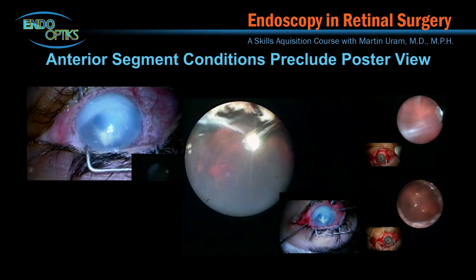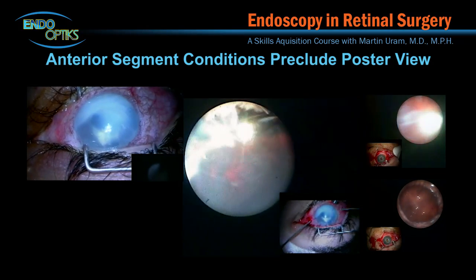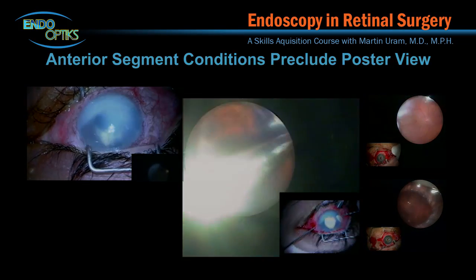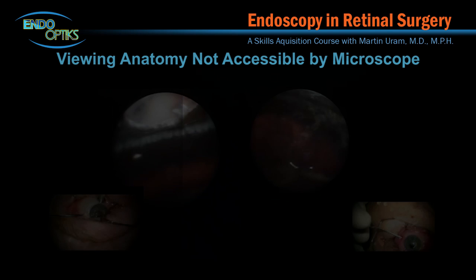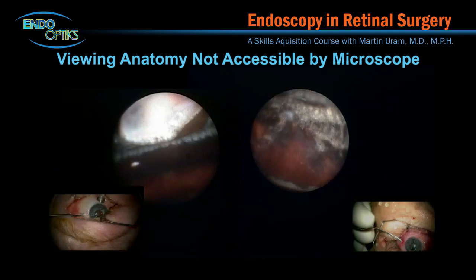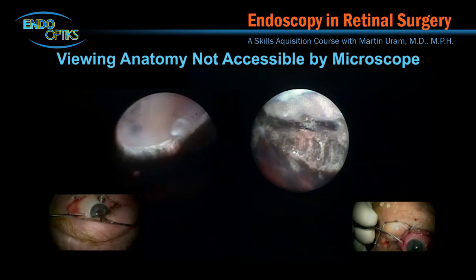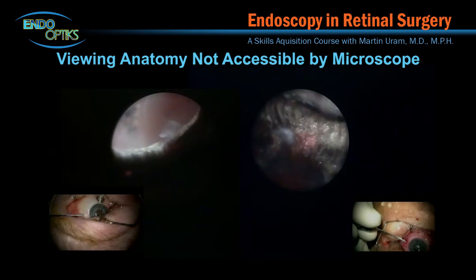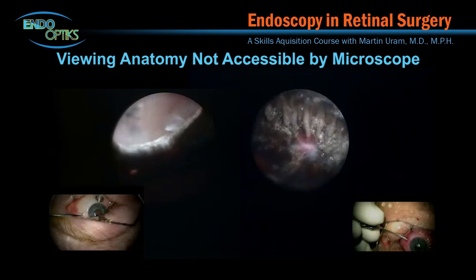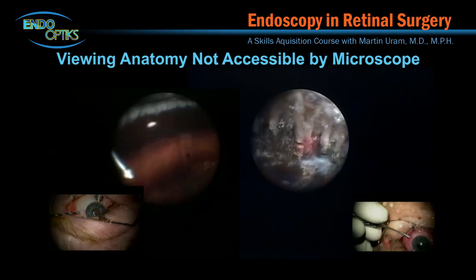These videos demonstrate that despite an opaque cornea or a miotic pupil, surgery may proceed unabated. In these examples, the peripheral retina, pars plana, ciliary body, and posterior iris regions are easily imaged with good resolution and wide field of view. This is not possible through the operating microscope.